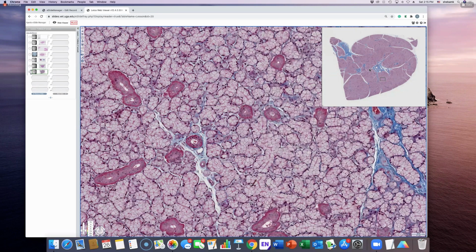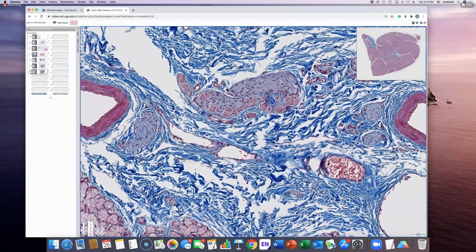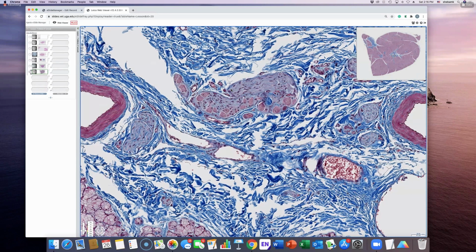Okay, so it's obviously in the peripheral nervous system, the periphery somewhere. So what would you call this aggregation of nerve cell bodies? Ganglia? Awesome. So this is a peripheral ganglion. You can safely call this an autonomic ganglion. Okay. So this is in the periphery and it's associated with unmyelinated nerve fibers.